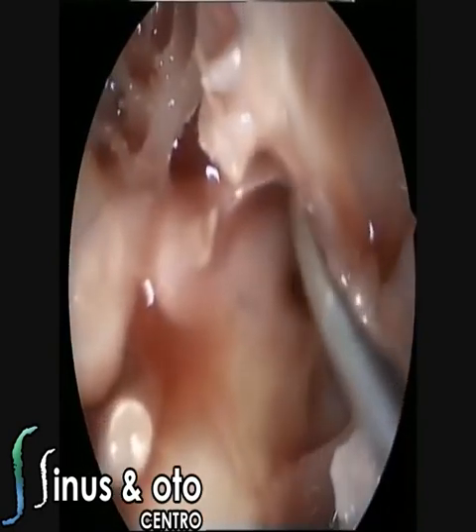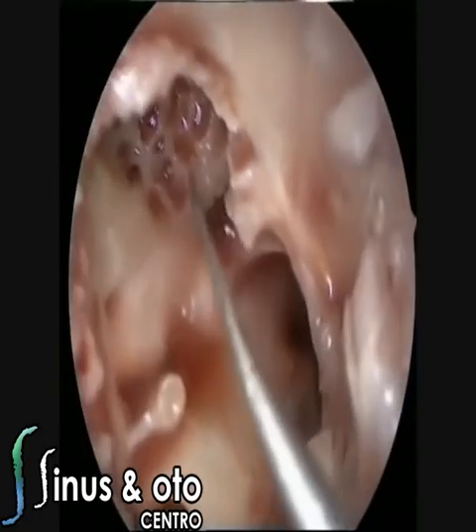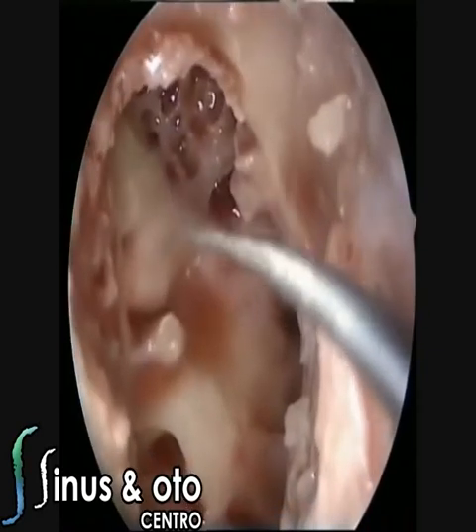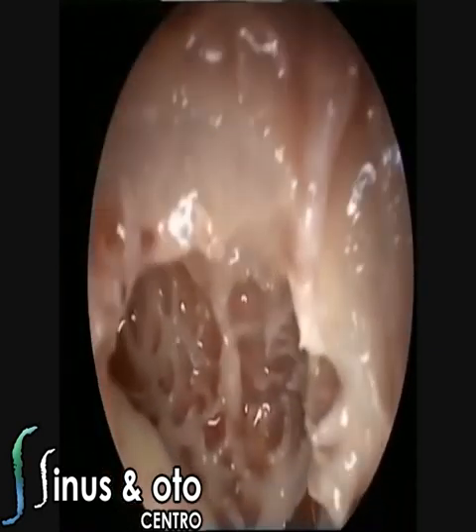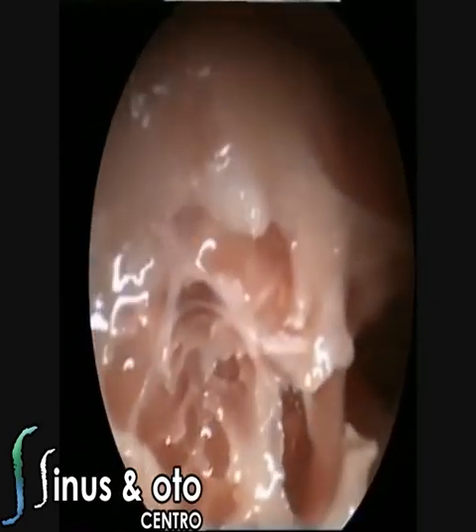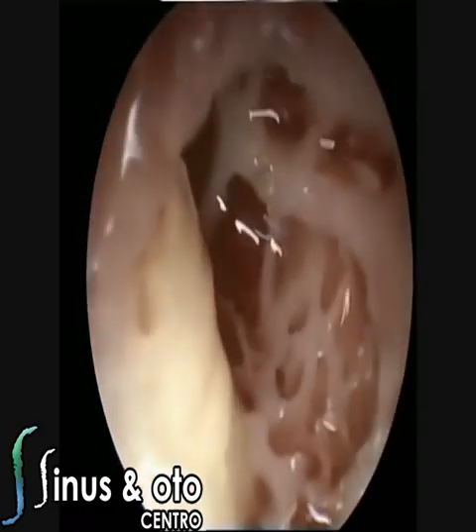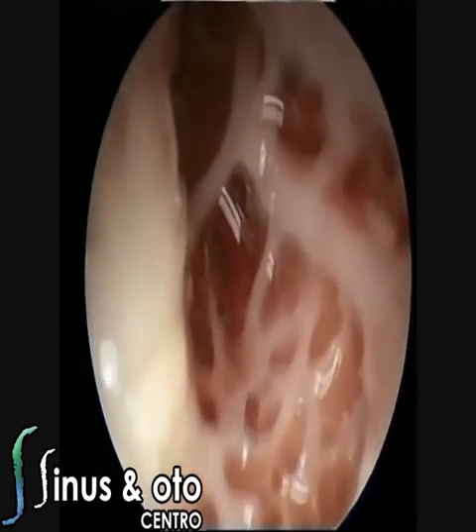Of course, when you talk about inflammatory disease, especially cholesteatoma, and when you do canal wall up procedures, canal wall down procedures, you have recurrence and residual rates. When we talk about endoscopes in cholesteatoma surgery, in the worst case scenario, the recurrence rates and the residual rates are equal to canal wall down procedures, while doing a less invasive procedure. So it's a very excellent tool.